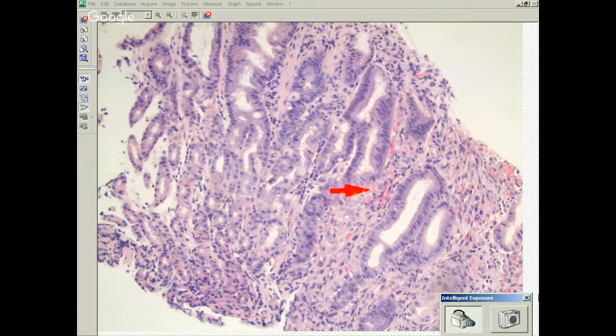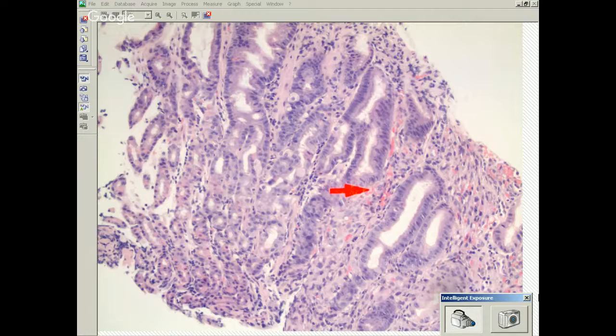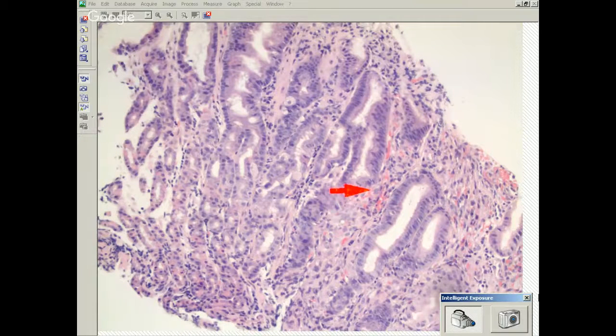And on their report, if they describe it as a purple raised lesion, you know, really you should be doing a stain for, what stain do we do? HHV8. HHV8. CD34 would also be positive, but HHV8 is specific, right? So that would be positive. So if I have that stain. I'm pretty sure I have the same. Give me one second. Aha, here it is.